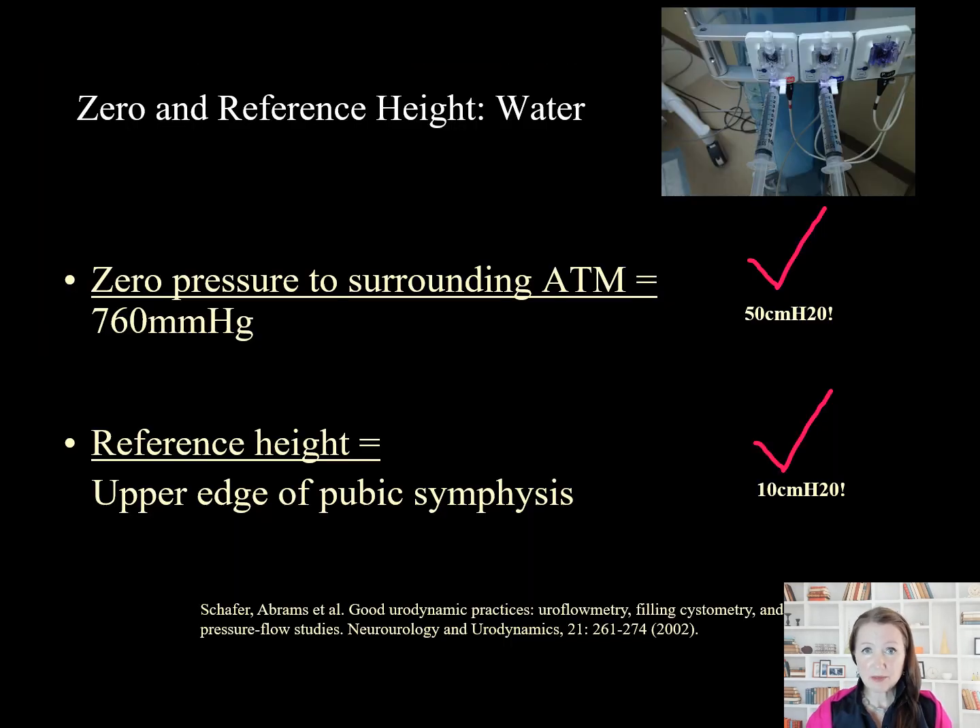Appropriate zeroing to atmospheric pressure and adjustment of transducer height is essential to a high-quality study. Omission of zeroing introduces artifact as high as 50 centimeters of water. Failing to place the transducers at the height of the pubic symphysis can introduce 10 centimeters of water error — numbers large enough to misinterpret a surgical diagnosis such as bladder outlet obstruction.